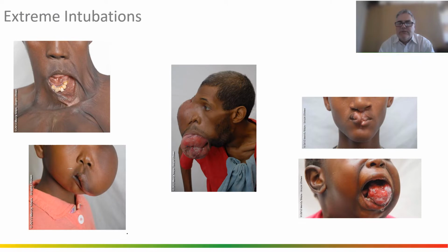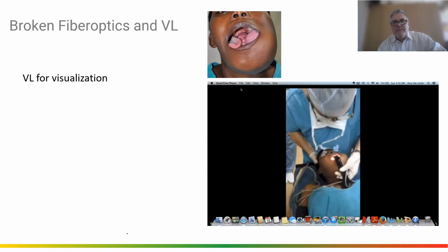These are the sorts of airways we were managing. These are max-fax cases, very difficult intubations to manage. Initially, I was using a lot of fiber optic intubation techniques, awake and asleep. At one point, our fiber optic bronchoscope broke.